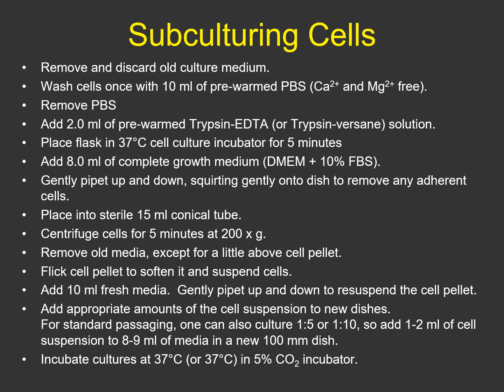The thing to keep in mind is trypsin is an enzyme, so it will keep working, and you don't want to incubate it for too long. So I say incubate for 5 minutes, because if you keep incubating, it's going to cut up all the proteins in the cells, and then they're going to die. The other thing is you note that we place the flask at 37 degrees Celsius. Again, that's because the enzyme-mediated reaction, like most reactions, will proceed faster at a higher temperature. So at 37 degrees, it will proceed at a reasonable rate so that in 5 minutes we'll get the appropriate amount of cutting.